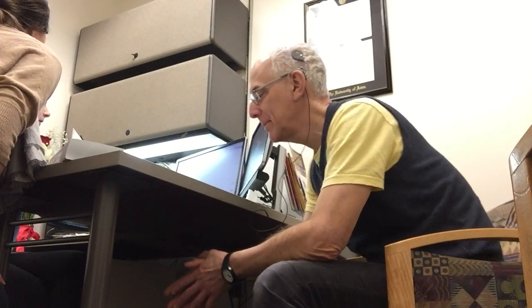So now we're going to create your settings. To do that, we're going to have you listen for some beeps. They're going to be very soft beeps for some of them, almost like the hearing test. We'll have you count how many beeps you hear as best you can. You'll hear 1, 2, 3, 4, or 5 beeps. And don't cheat and look at the computer, okay? Oh, I see, you've got it up there somewhere. All right, great.